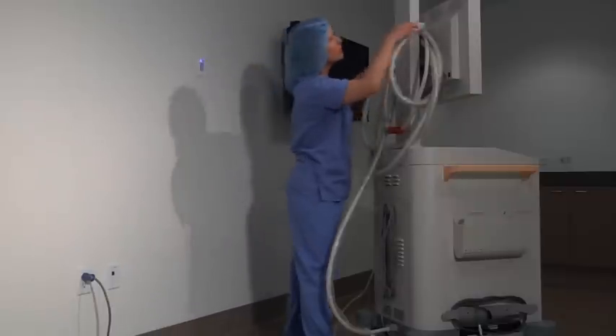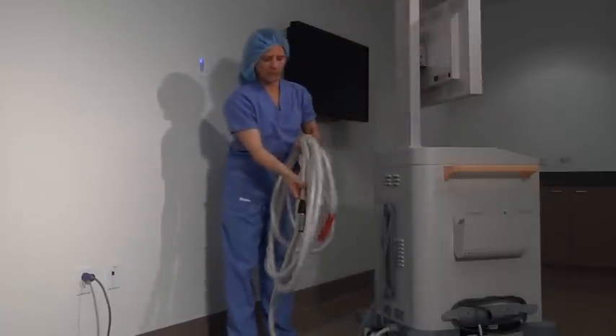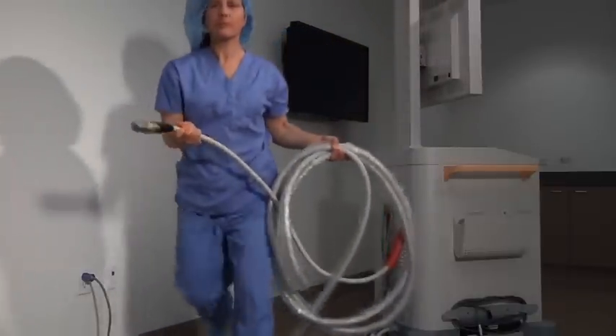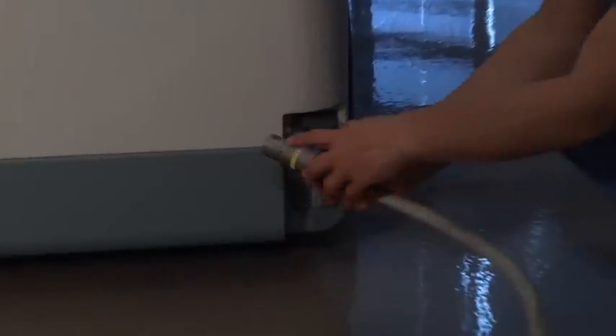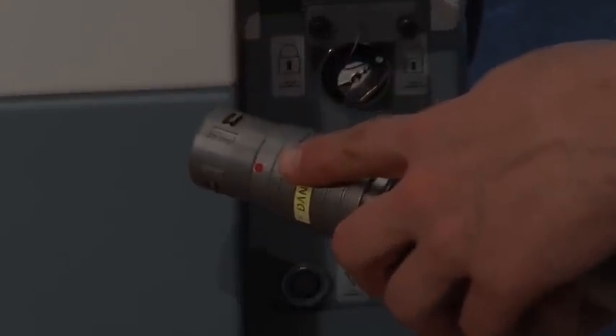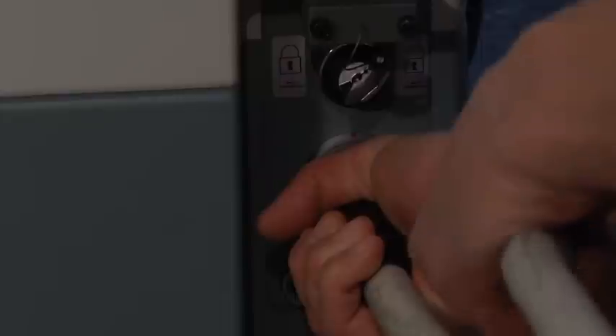Next, take the large interconnect cable from the MVS and plug it into the OARM. There's a connection port at the bottom rear of the OARM cabinet. Align the red dot on the interconnect cable with the red dot on the cable port and insert the cable.